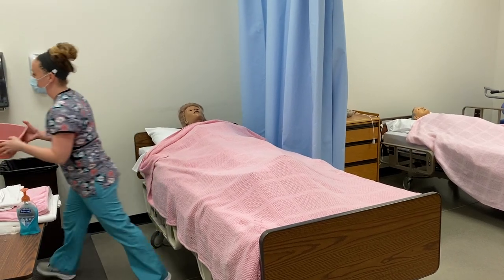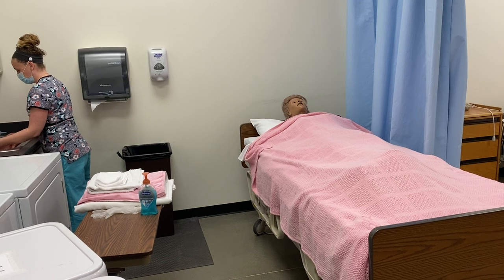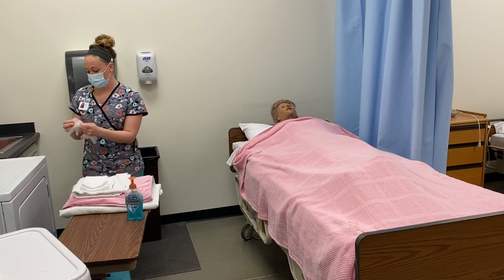I'm going to fill my wash basin with some warm water. While that's filling up, I'm going to put my gloves on.